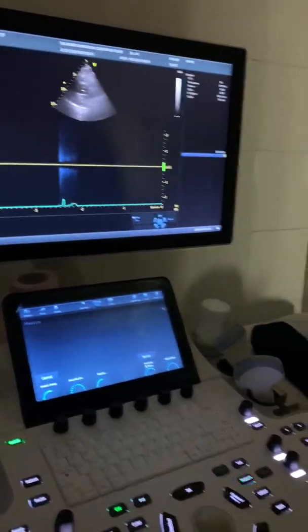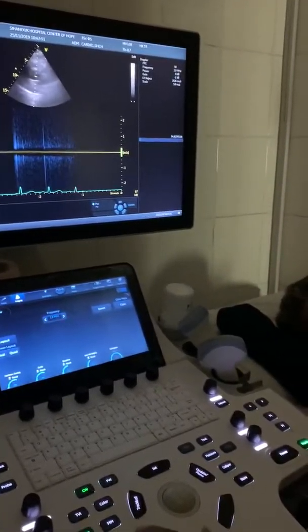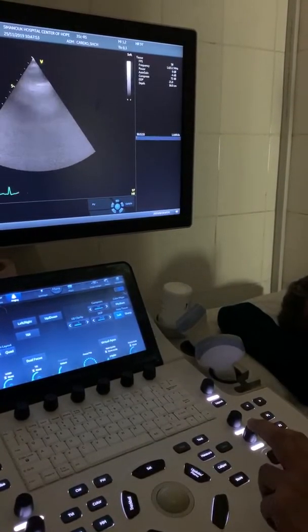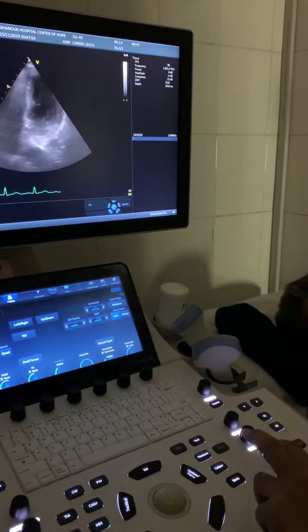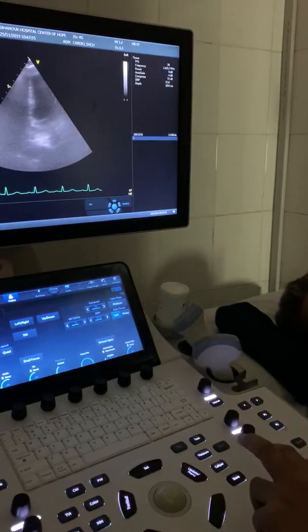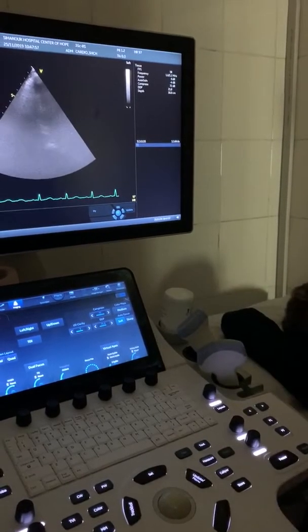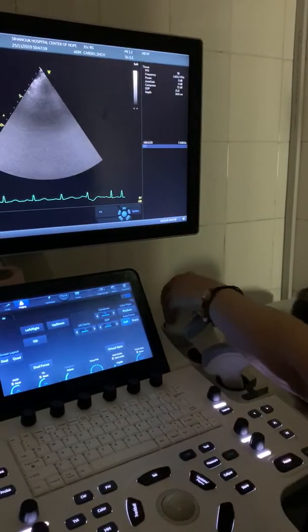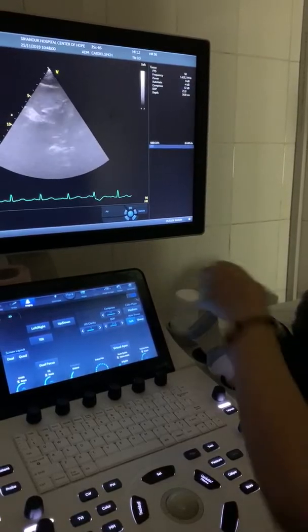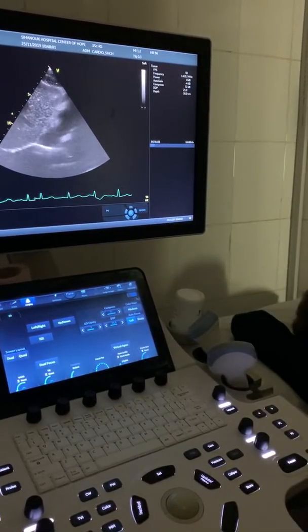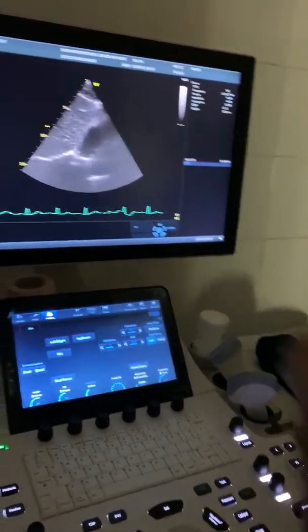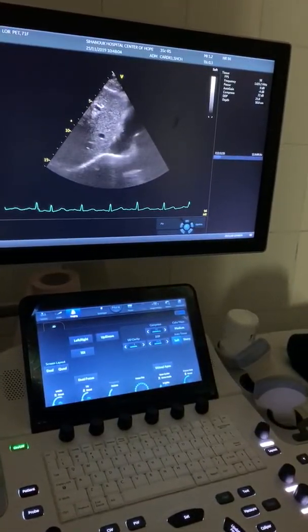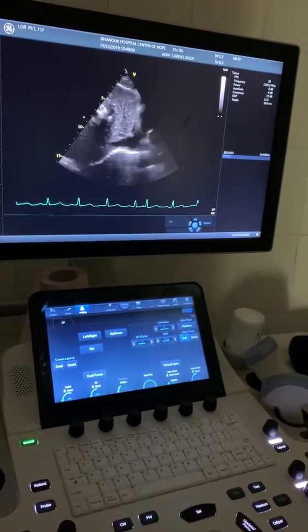Okay, we'll not do anything more from here. I wish I could show the tricuspid, but because she's lying flat she may be changing her position. Do you do pulmonary? Do you do IVC? Yeah, everything - very good.